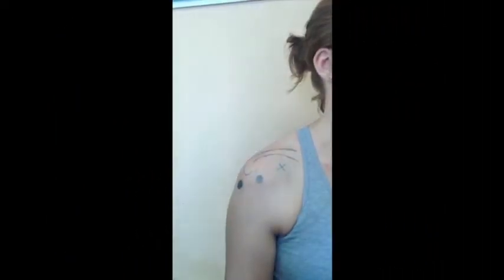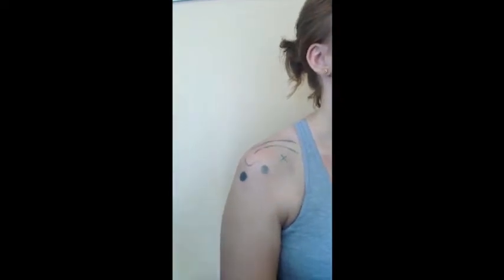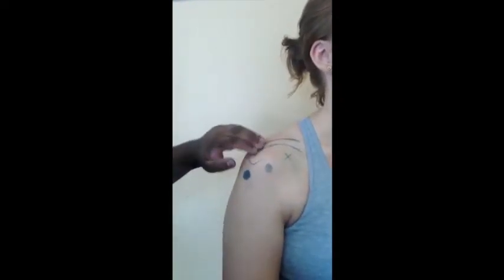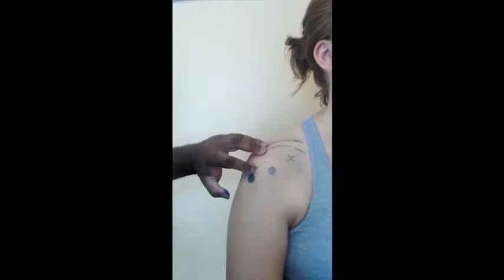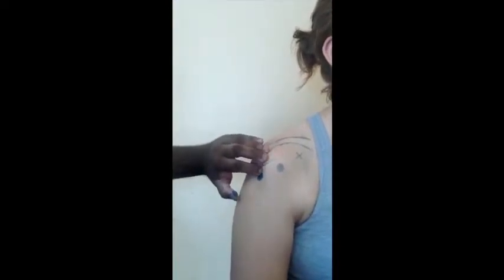Then moving on to the subacromial approach. You palpate the clavicle and the acromion, and just below that you should feel a slight dip or groove, and it's at this point where you'd insert your needle.